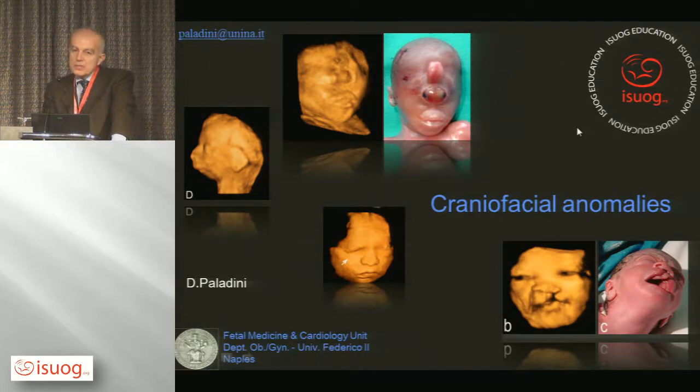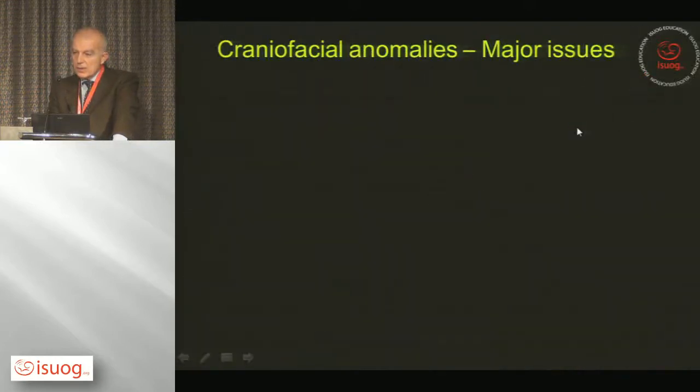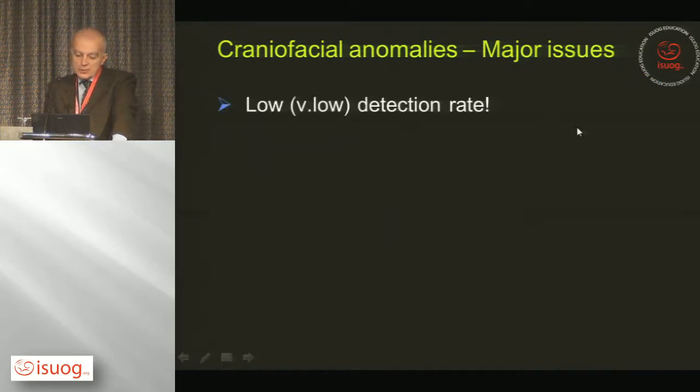I will try to cover the issue of craniofacial abnormalities, mainly basing my talk on the second trimester, when the mid-trimester anomaly scan is carried out.